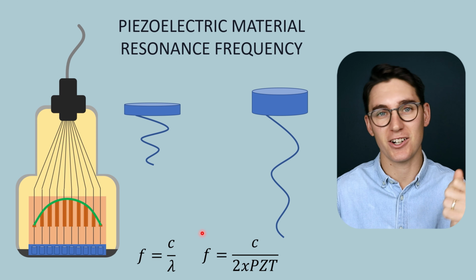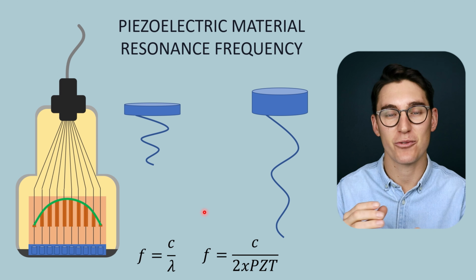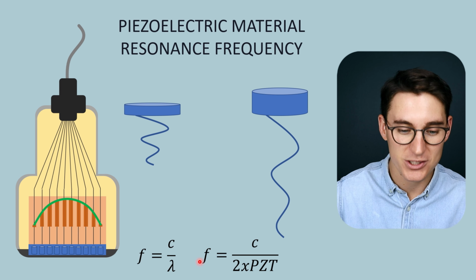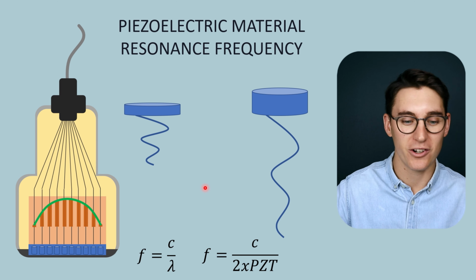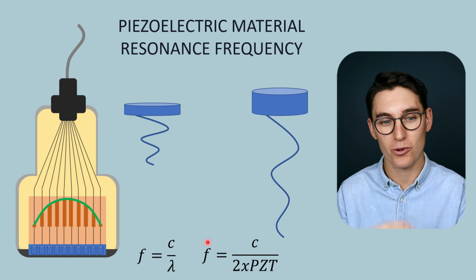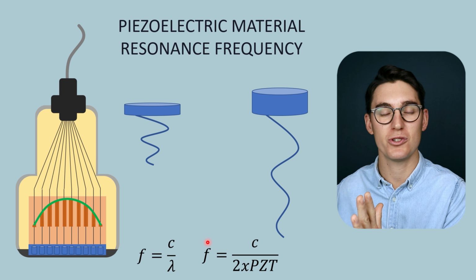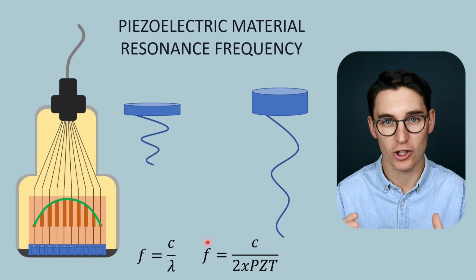Now when we get an ultrasound transducer, it will have a resonance frequency, and that frequency is dependent on those piezoelectric crystals here. And these are values that you can calculate, and I've linked a question bank below where we go through calculating some of these frequencies. Now the speed of sound traveling through these PZT crystals is very high, and it's going from our transducer into soft tissue, where the speed of sound is much slower.